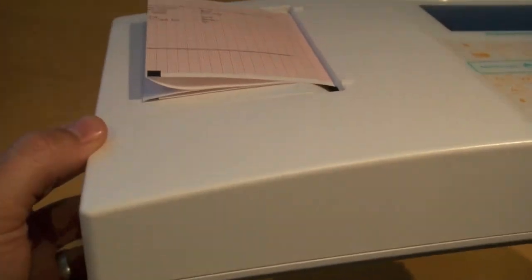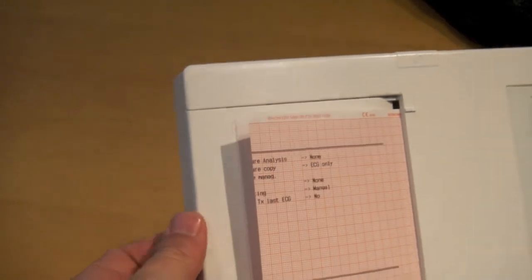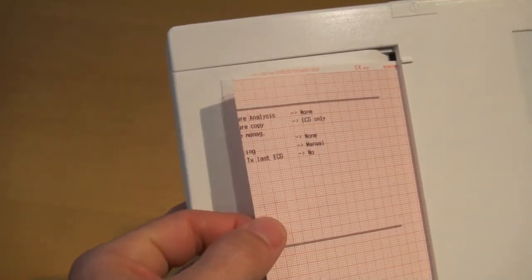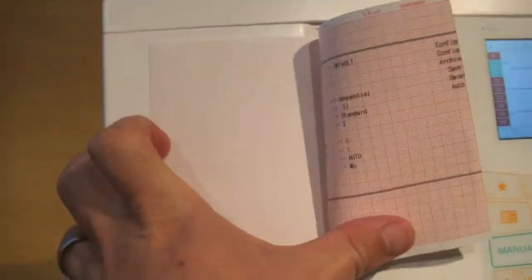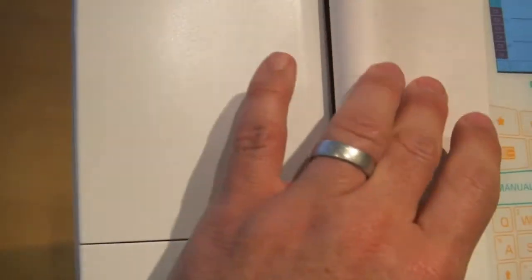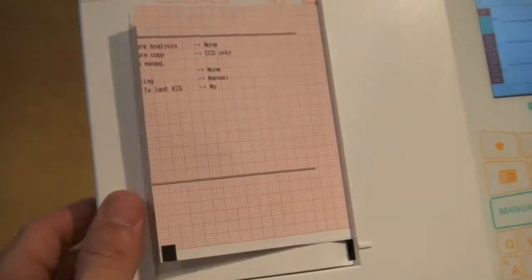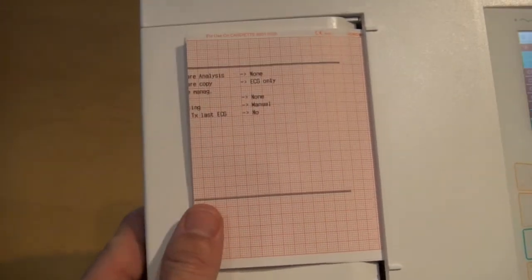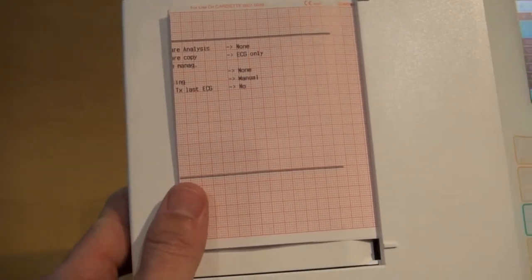There's no connections across the bottom of the machine. And then here's the paper door for the thermal printer. You can see here the average size of the paper. It is a six channel or half a sheet printout.